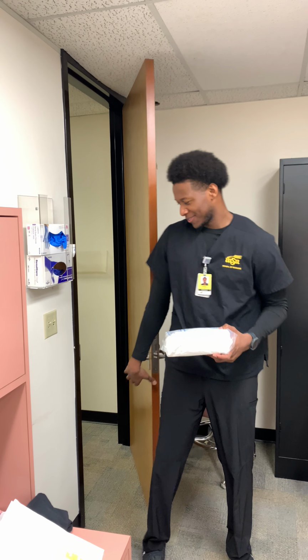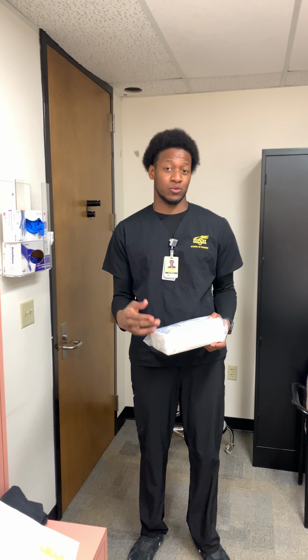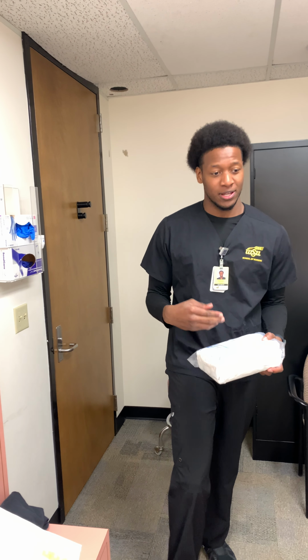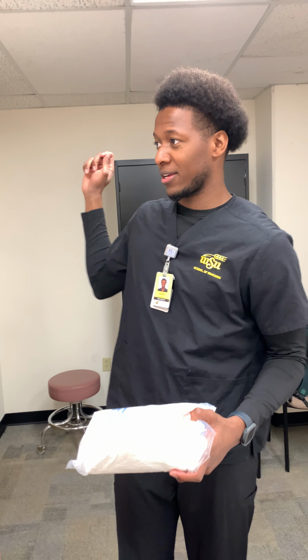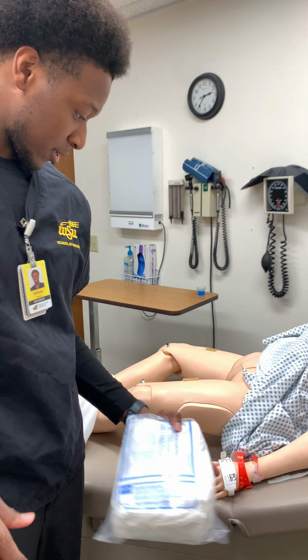Hello. Before entering this patient room, I'll make sure I have the correct orders and the correct equipment. Then I enter, introduce myself, and make sure I perform hand hygiene. After introducing myself, I'll provide privacy, come over, and verify the right patient and the date of birth.